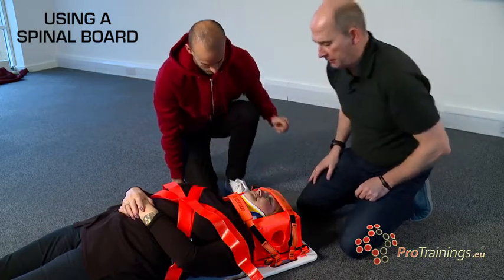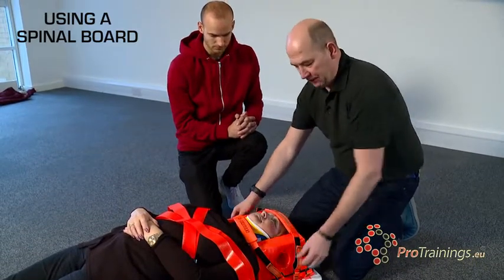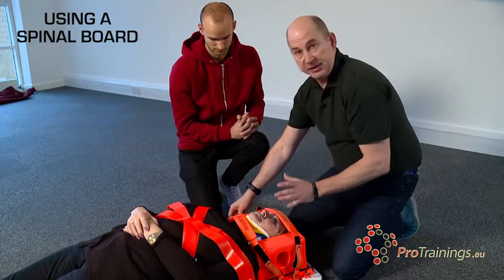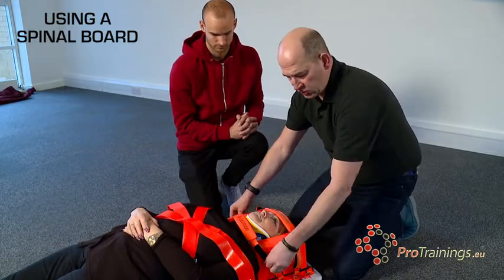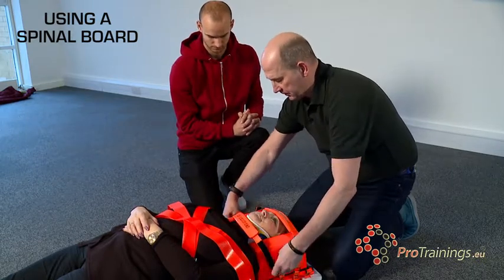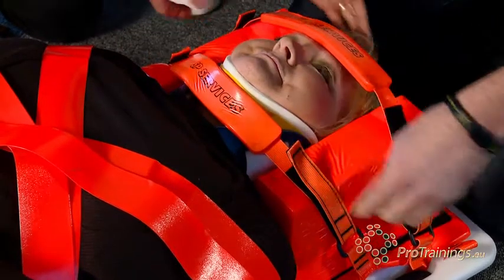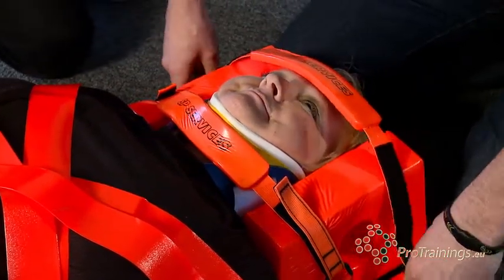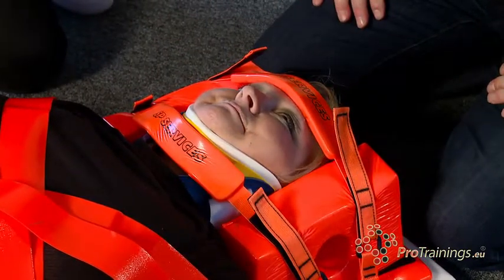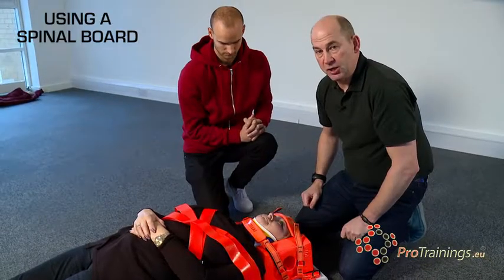You can let go completely now. There is a proper way to tighten the straps — if we just velcro one side and pull the other it rotates and rolls the head. Instead, grab both straps with the chin piece centred on the chin, put your thumbs onto the head blocks, push down with your thumbs and pull the pressure directly down for an even pull. Do the same with the head strap, and once the blocks are tight the patient is safe to move.